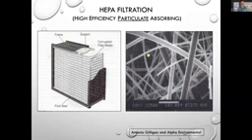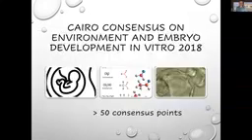And yes, they should have HEPA filtration, but for aldehydes and VOCs, in this diagram, if these are the pores in a HEPA filter, and this yellow dot represents an aldehyde 10 times its size, you can imagine that it absolutely has no effect on VOC transmission and aldehyde pollution. So HEPA filtration, great, but you do need either mechanical or chemical filtration before the HEPA filtration.